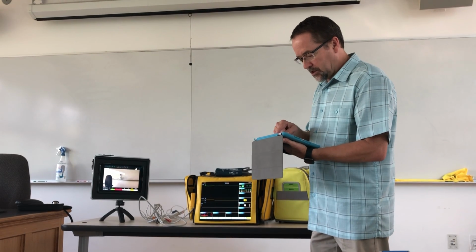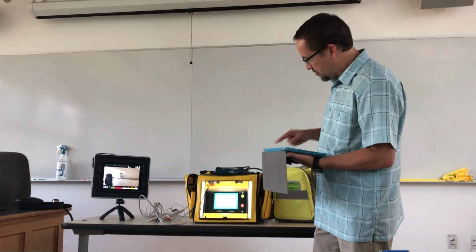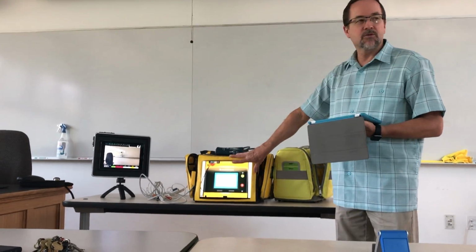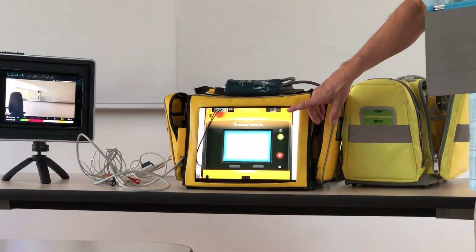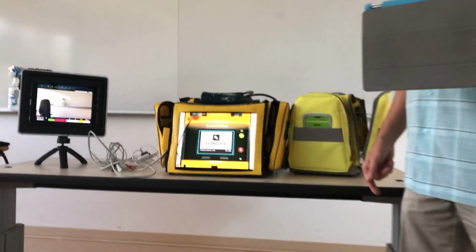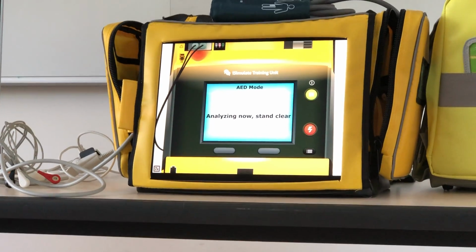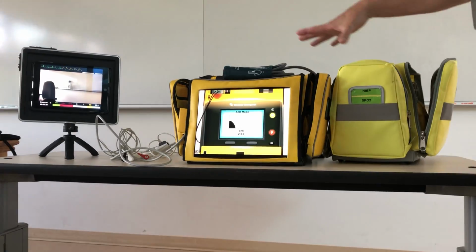So let me start a scenario, and now I can pick. We could do it with that generic AED. The one thing I don't like about this one, and I don't know if we wrote this one down before, is it starts up assuming you've already connected the pads. So it goes straight to analyze mode as soon as it fires up. It needs to power up, tell them to connect the pads, and then come around to that. It doesn't, and I'm not sure why.